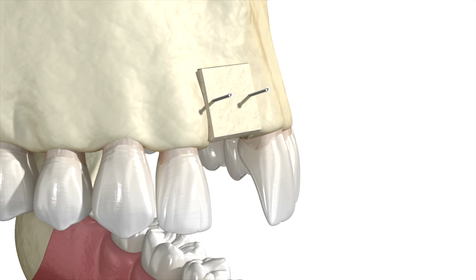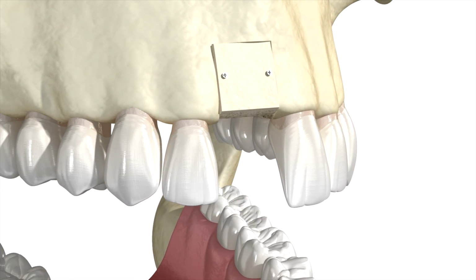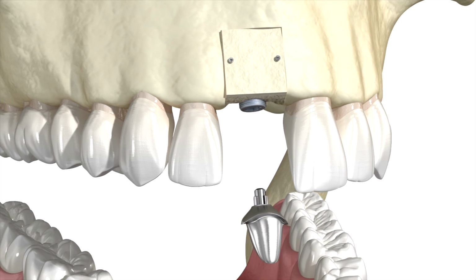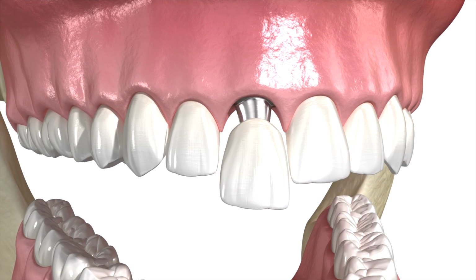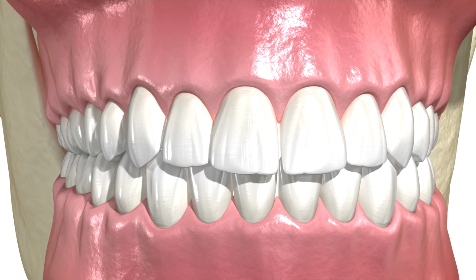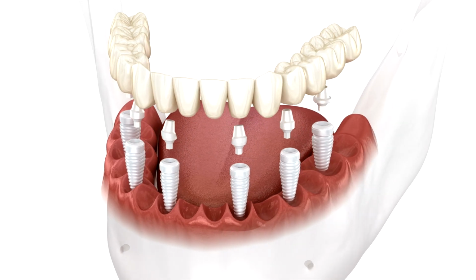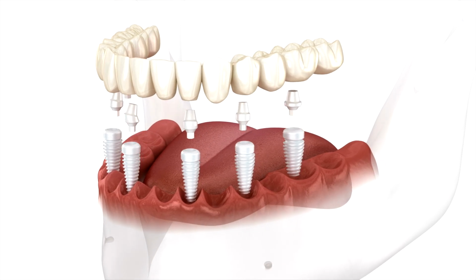It provides detailed information about bone density, height, width, the exact position of the sinus, the nerve canal, undercuts, cortical thickness, and angulations. With CBCT, surgeons can create a virtual surgical plan, selecting implant length, diameter, exact angle, entry point, and depth. Computer-guided surgery further enhances accuracy by allowing implants to be placed through a surgical guide. This minimizes human error and provides predictable, safe outcomes.